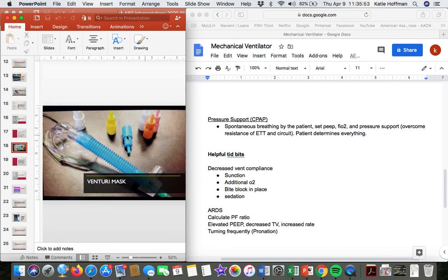If it doesn't directly match up, meaning your patient is on 10 liters of oxygen at 45%, then choose the option higher. So say you were on 10 liters at 45% and your only options on the white piece are 8 liters at 40% or 12 liters at 50%, you want to choose the higher option for traveling. You just click the white piece or blue piece together with that additional white piece. I hope this makes sense.